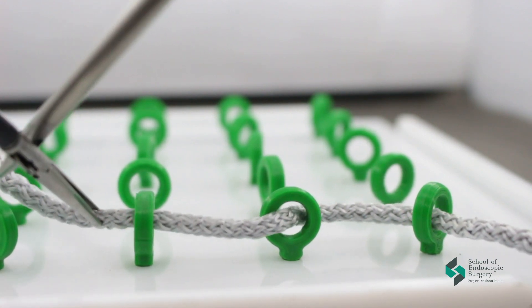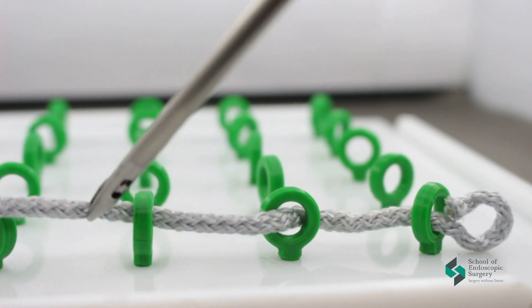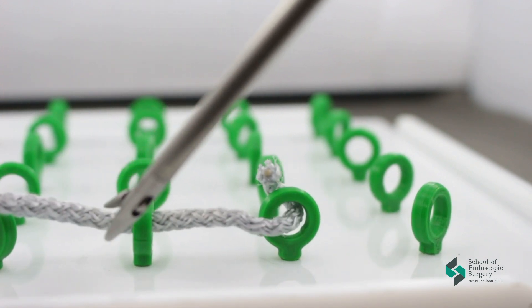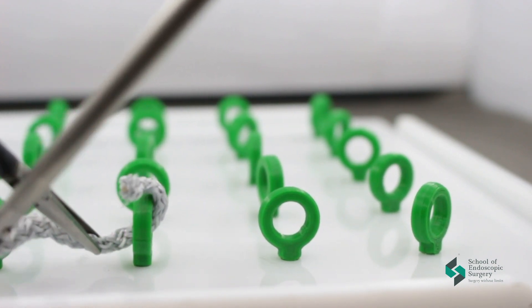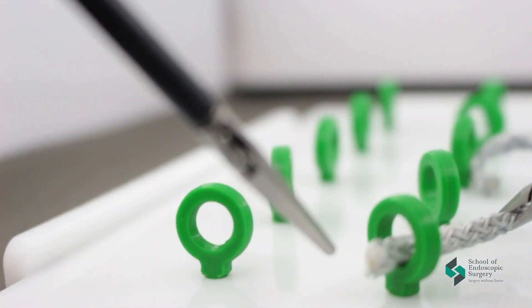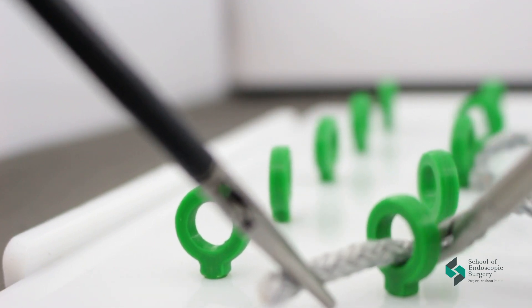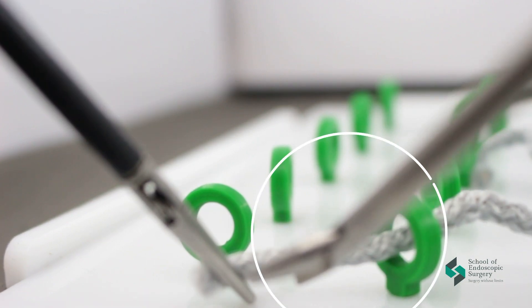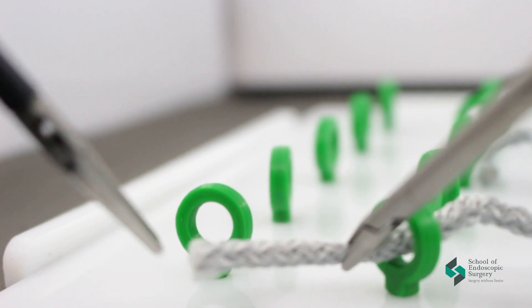Try practicing thread pulling — it will help you work with precision. Thread rings in different directions, simulating different angles of attack.